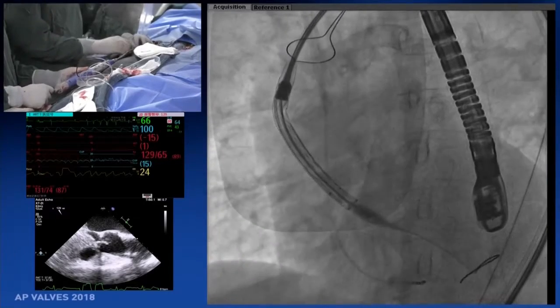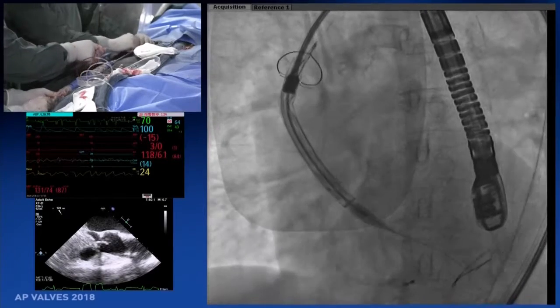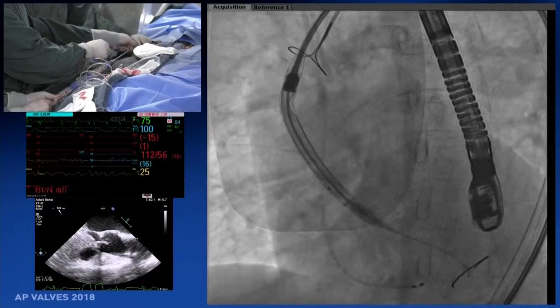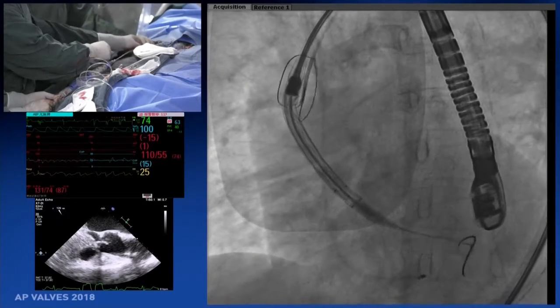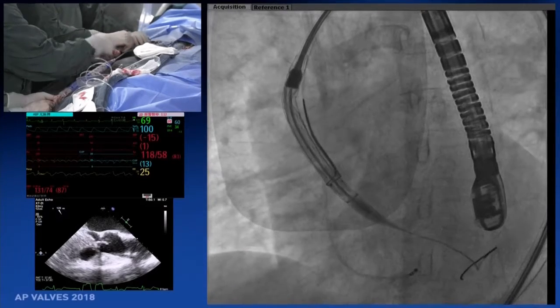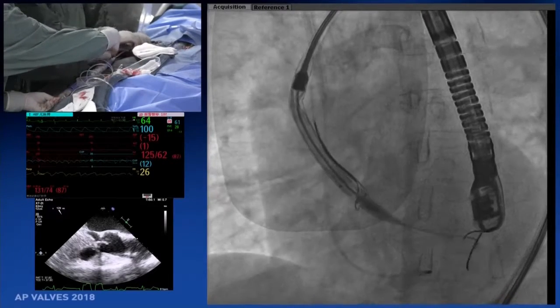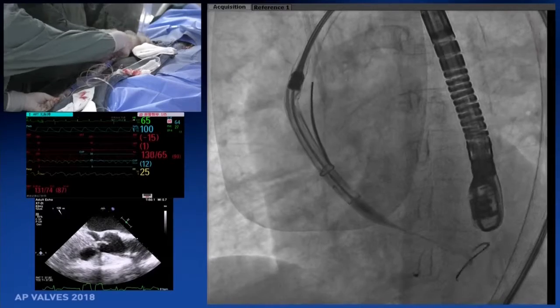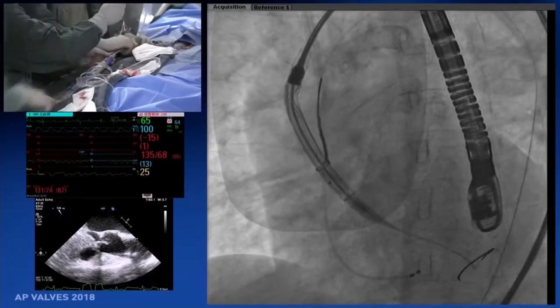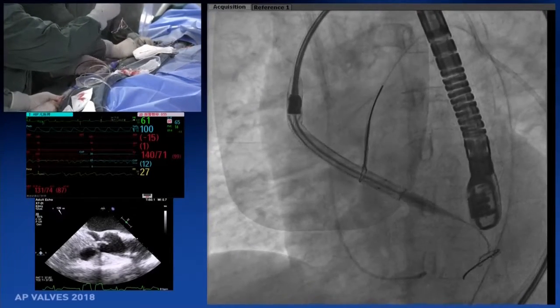I mean, you are saying use an Edwards valve, but as far as I know, the Edwards results in China with these valves are not optimal, right? No, I know, but what I'm saying is any valve that's shorter than the long stick you have here is probably so hard to get horizontal. I think the Edwards XT is not very good for this because XT is too short. It's very easy to be missed and then it flies. I think the S3 will be better, but they are obviously just testing S3 now. They don't have S3 in China. They don't have anything.